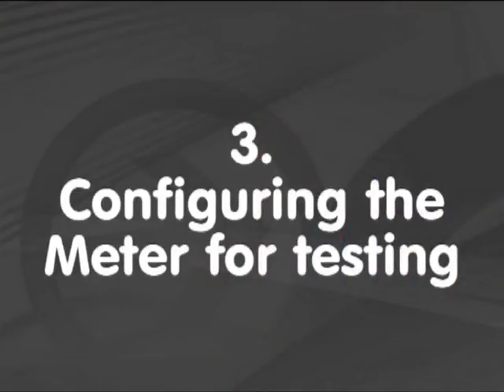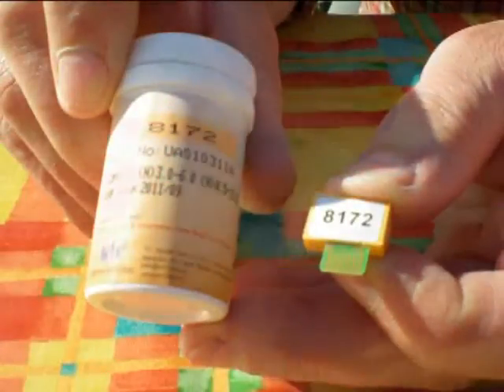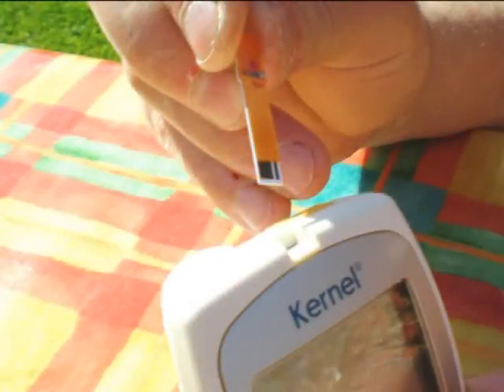You then need to prepare the meter. First of all, open the tub and remove a testing strip and the chip. Make sure you put the top straight back on the tub, as this helps to preserve the life of the strips. Check the code on the chip corresponds with the number on the tub before inserting the chip into the back of the meter. To then start the meter, insert the test strip into the top of the meter with the coloured side of the strip up.